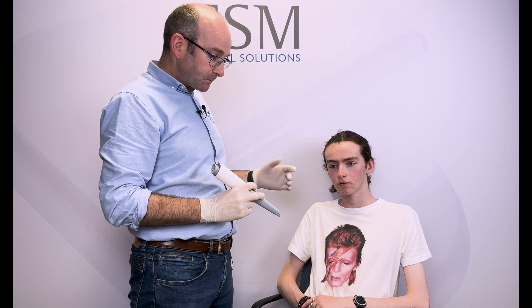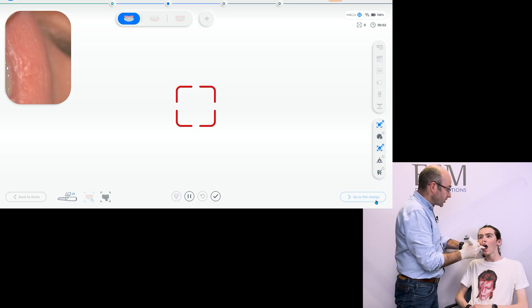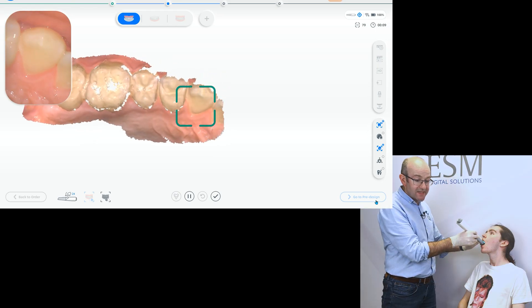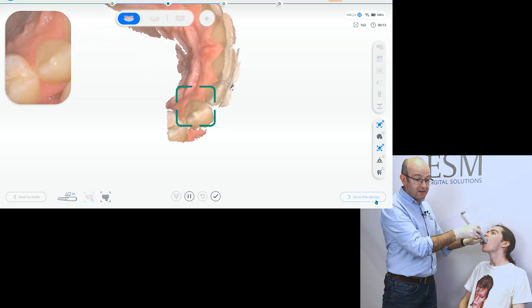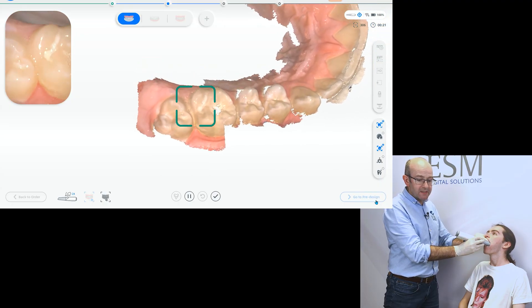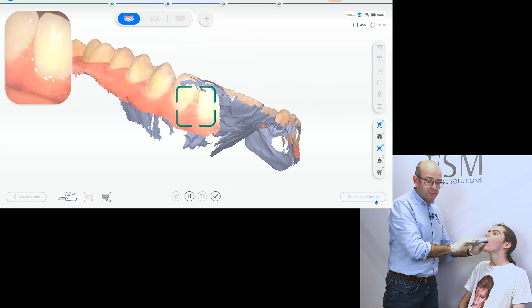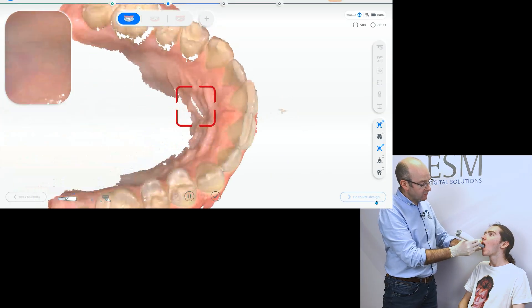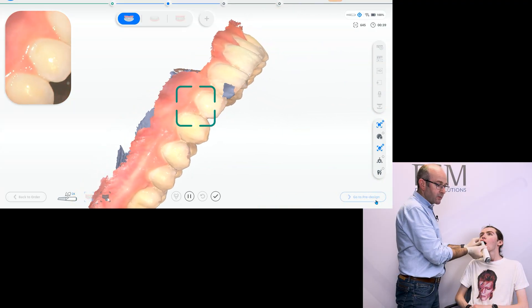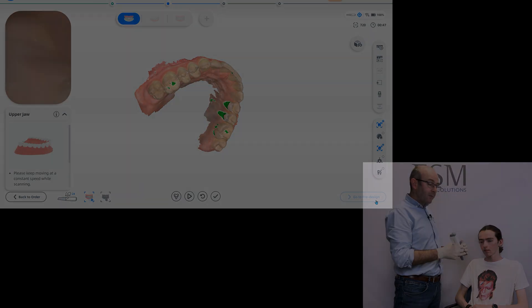Let's get going — we're going to scan the upper arch first. We'll turn the scanner on and get into position. You'll notice that as I scan I tend to use my left hand as much as my right hand: my left hand is there for guidance, for retraction, and to help stabilize the scanner. We always like to start off with a good occlusal scan, then roll over and scan the buccal surface. On the buccal, I like to scan from the back out to the midline, then reposition and start on the other side, sweeping around to the midline again.